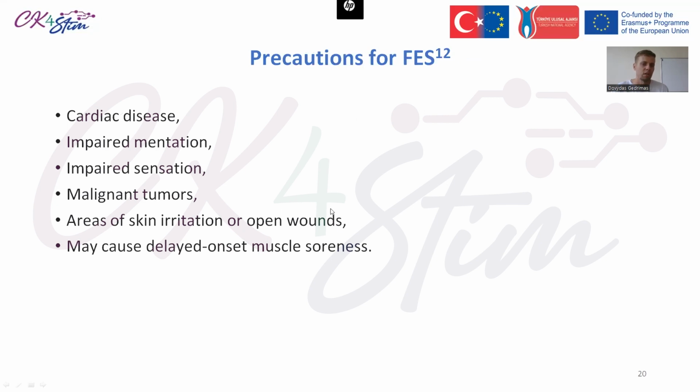And precautions are cardiac disease, impaired mentation, impaired sensation, malignant tumors, areas of skin irritation or open wounds. It may also cause delayed onset muscle soreness, so that should be mentioned to the patient in advance.